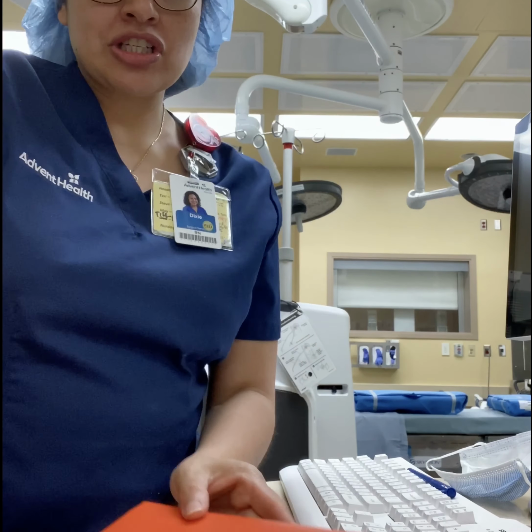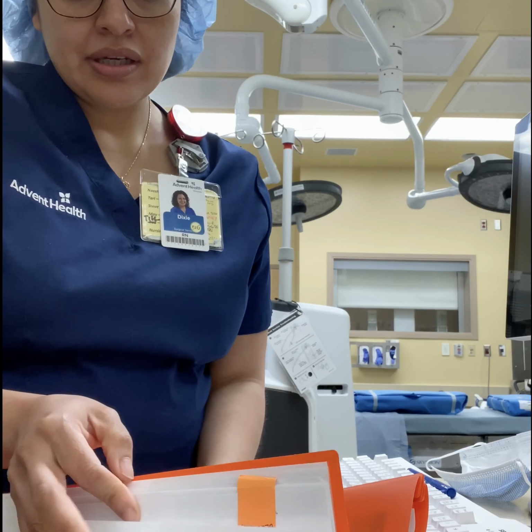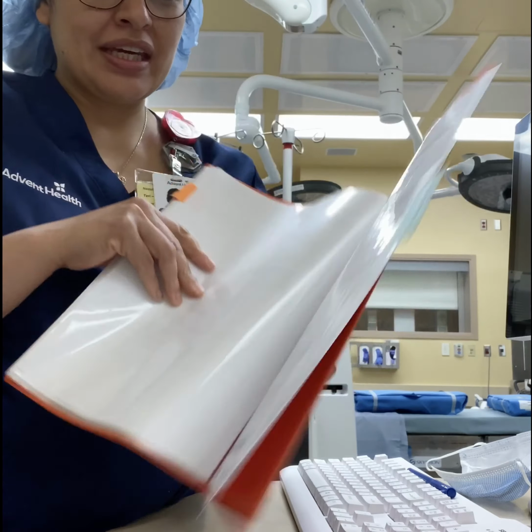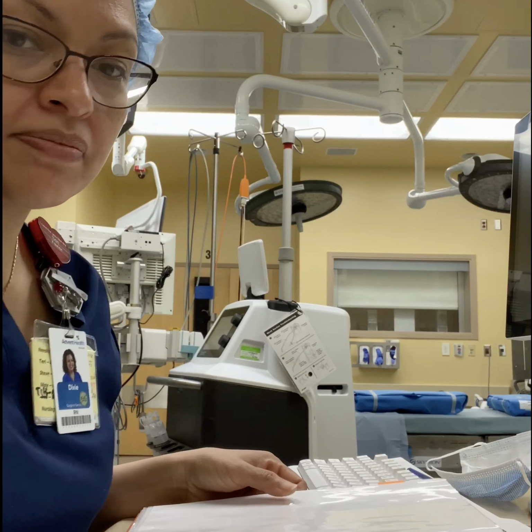So just to let you guys know, this little orange folder, which was on the system cart, has a tab that says digital ureteroscope on it. It should provide the step-by-step on how to hook it up if you're ever in a bind. So let's go ahead and start.